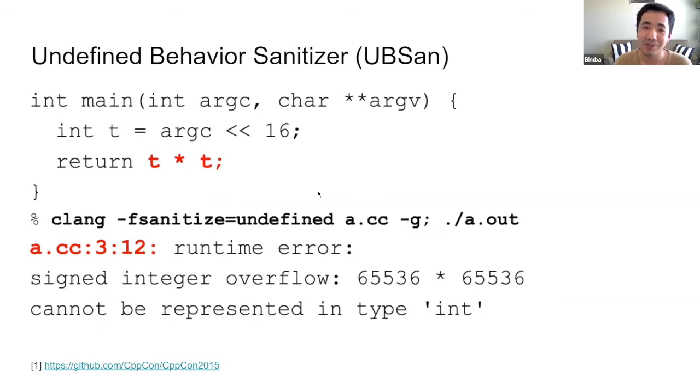If you've ever run UBSan on your code, you'll get a ton of noise, most of which doesn't really matter. Some of it does, but most of it is just that it's not conforming to the C++17 standard or something. Sometimes it's helpful, but most of the time, in my experience, it hasn't been.